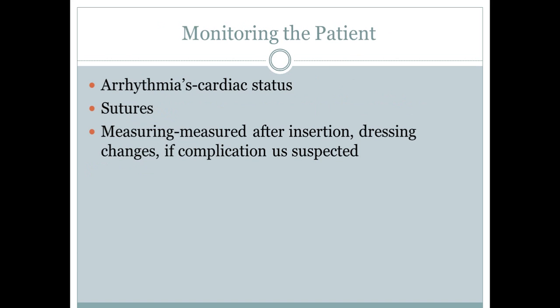One of the things you are going to monitor specifically for the PICC line, since that tip is located, again, in that superior vena cava, is possible arrhythmias or cardiac status. If the patient is not hooked up to a monitor and you cannot visually see it, but the patient starts complaining that it feels like their heart is fluttering, or that their heart just seems to be beating weird, that might be a situation where the tip has somehow been maneuvered or moved a little bit further than it was. Even though PICC lines are sutured in place to help decrease that risk, it still can happen.